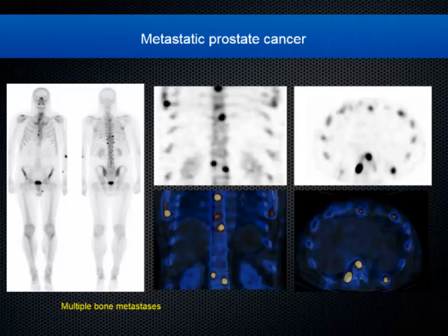I can easily say that could be all metastasis, but the only problem is if the patient has got an additional history that he's fallen a few days ago, then it becomes challenging whether it's traumatic or it is bone metastasis. Then it will make me slightly worried. Then I would ask for a SPECT CT.